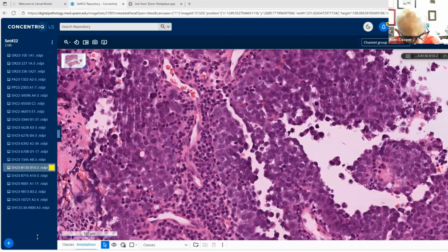So if you follow this, which is a useful way to recall all of these small round blue cell tumors, let me address this case. SMARC comes under S; both BRG and INI1 are intact. When we use these antibodies, I don't talk about positive and negative. I talk about deficient or intact, or absent or present. Positive and negative are confusing to surgeons who read these reports. So both BRG and INI1 were intact.